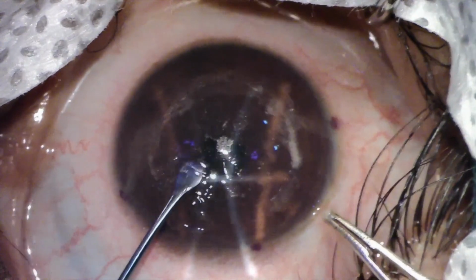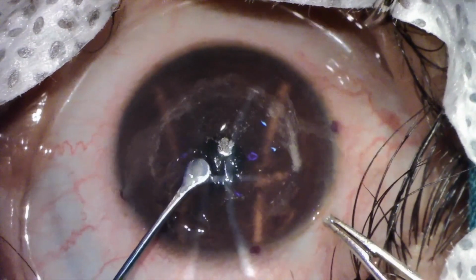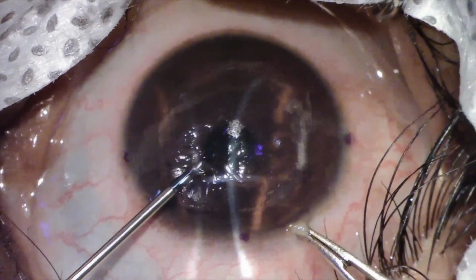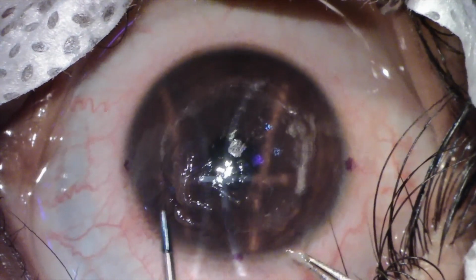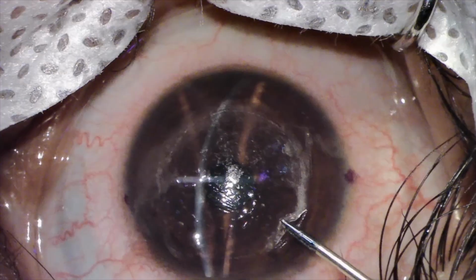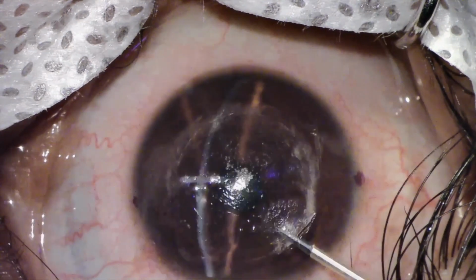In the left eye, the dissection was difficult because of the loose epithelium. There was a fear of cap tear or perforation and a chance of a false plane of dissection. A second incision was also attempted, however it was difficult to proceed due to loose fragile epithelium, hence the lenticule was retained.